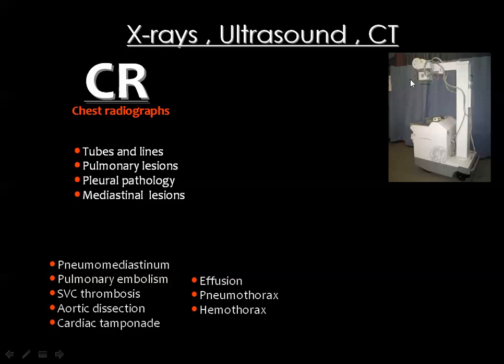While CT is now available in a portable fashion, usually it needs space in the ICU and certain facilities to do a CT scan. But I will explain the importance of CT in some conditions where you can move the patient to the CT unit, or if the portable CT is available and you can use it.